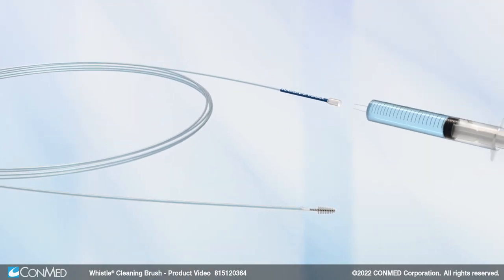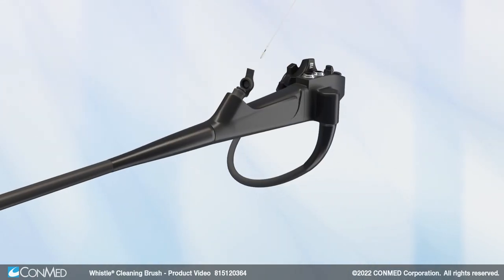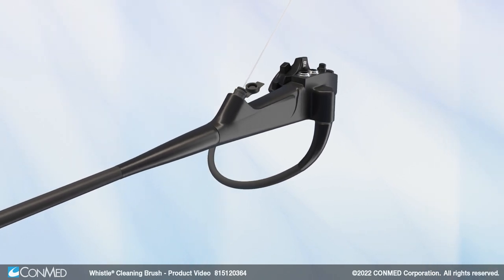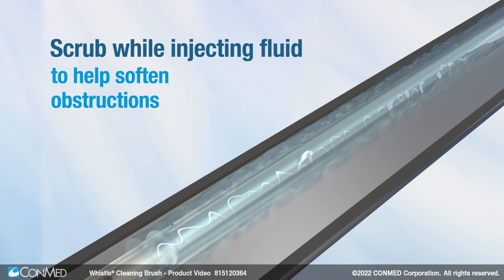Simply connect a 5 cc syringe filled with fluid to the lure lock and pass the brush through the scope channel. Scrub while injecting fluid to help soften obstructions.